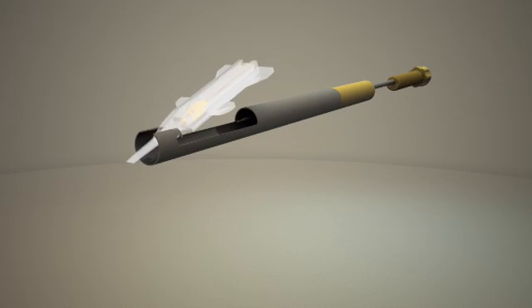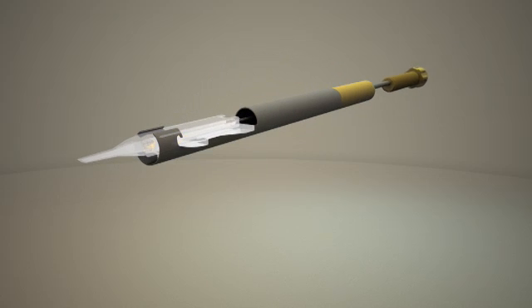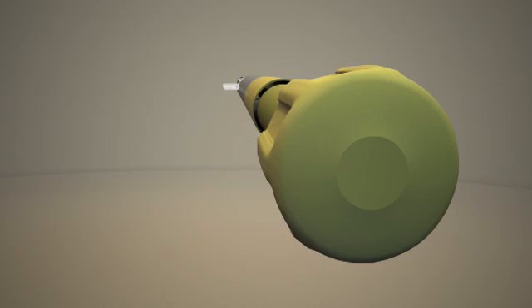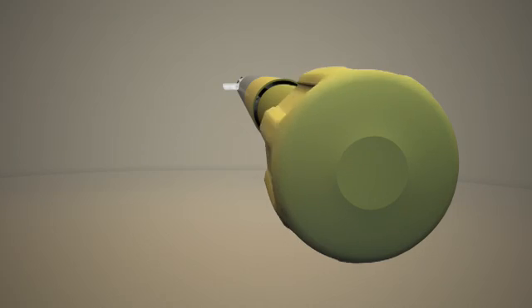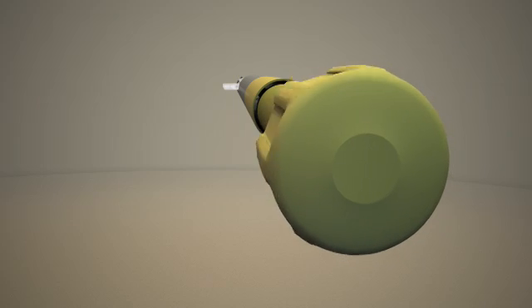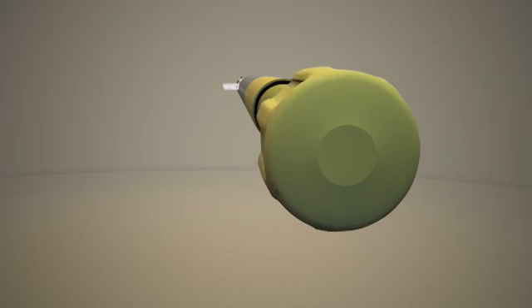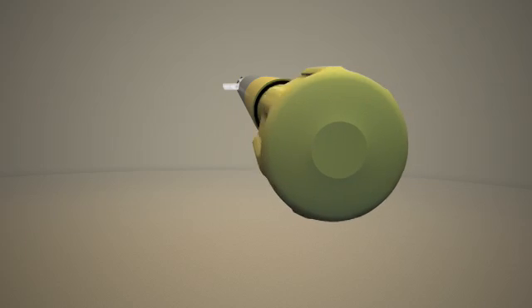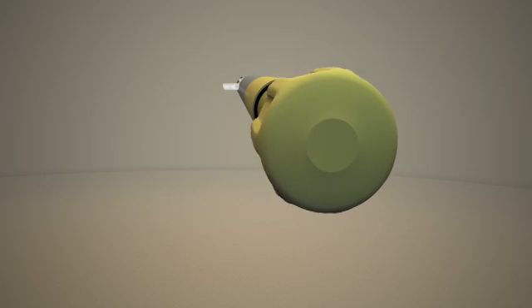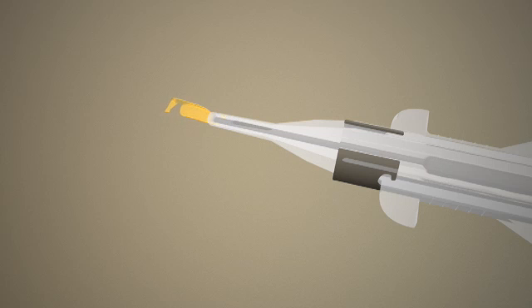Fully slide the cartridge into the handpiece slot. Turn the knob clockwise to engage the threads. Once the threads are engaged, press the plunger in one smooth, slow motion until the lens is delivered into the eye.